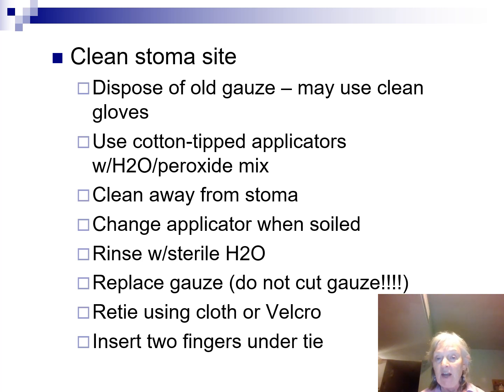Again, change your applicators when soiled. Do not put them back in the sterile water, even the dirty sterile water. You have to rinse anything you touched with clean sterile water, okay? Replace the gauze, but do not cut the gauze. You can either use a cloth tie or the Velcro to do it.